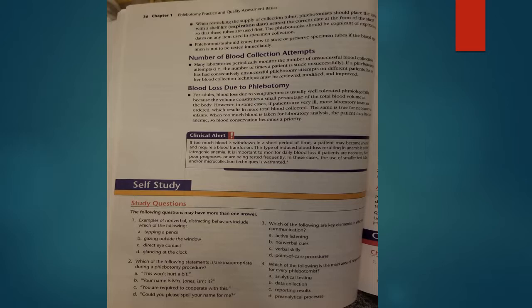When too much blood is taken for laboratory analysis, the patient may become anemic, so blood conservation becomes a priority. Clinical alert: if too much blood is withdrawn in a short period of time, a patient may become anemic and require blood transfusion. This type of induced blood loss resulting in anemia is called iatrogenic anemia. It is important to monitor daily blood loss if patients are neonates, have poor prognoses, or are being tested frequently. In these cases, the use of smaller test tubes and/or micro collection techniques is warranted. This concludes Chapter 1.